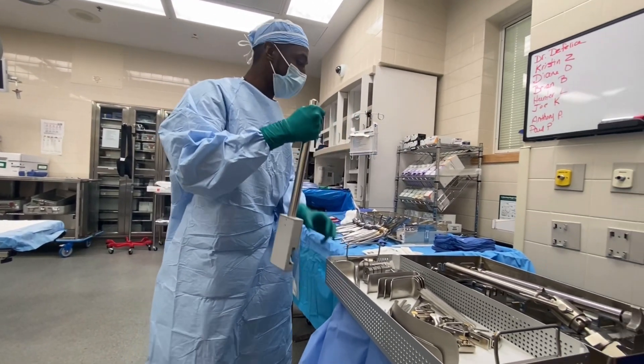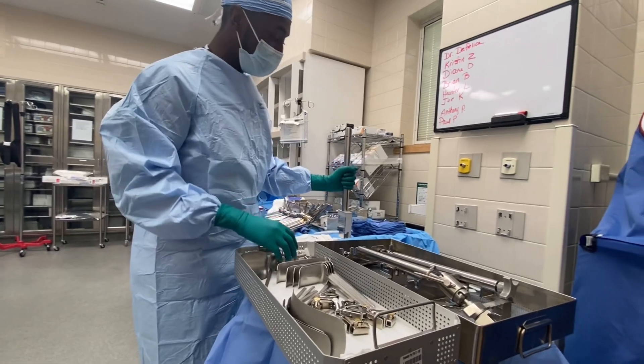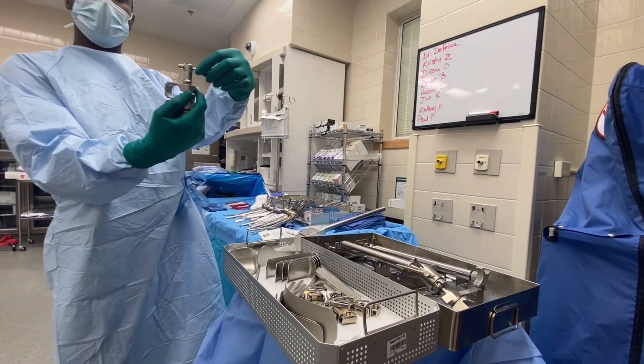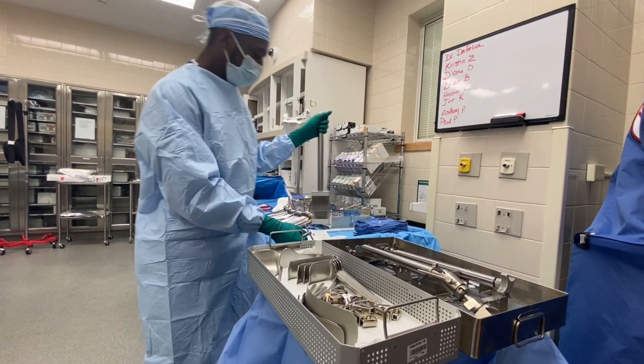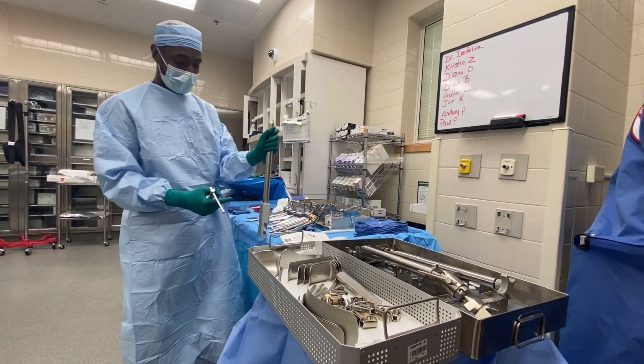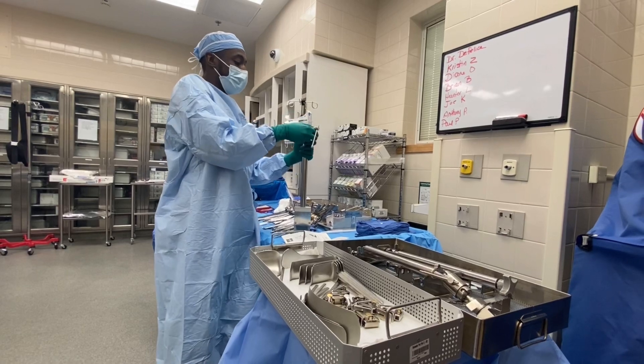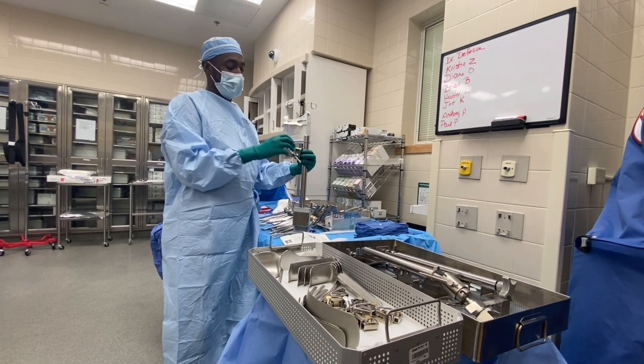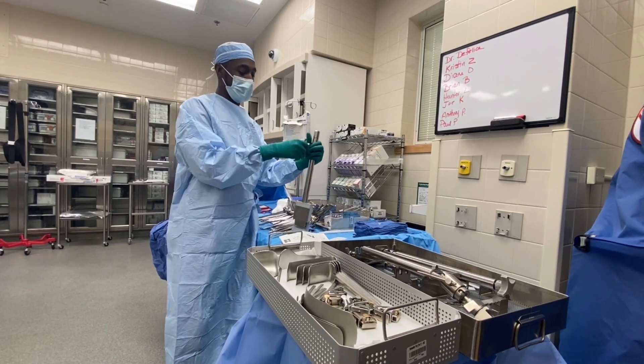Once the post is on the table, the second piece you'll give the doctor is the coupler. With the post attached to the bed, they'll take the coupler, put it on there, and tighten it.